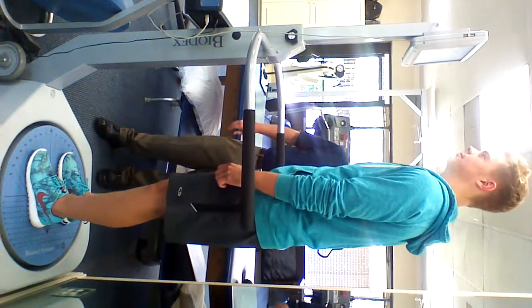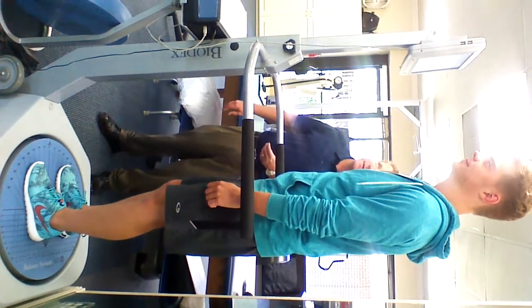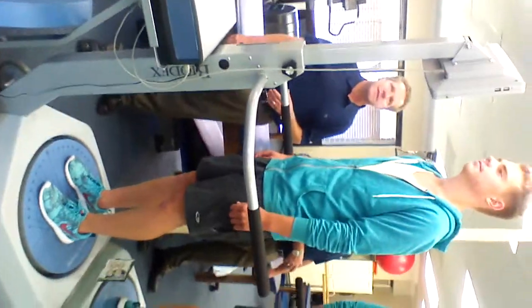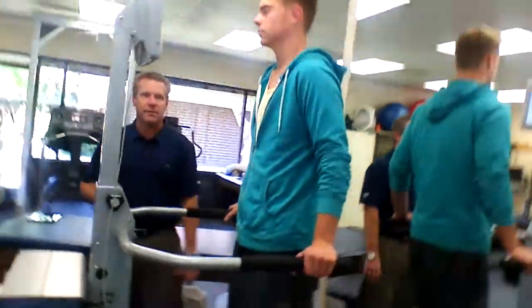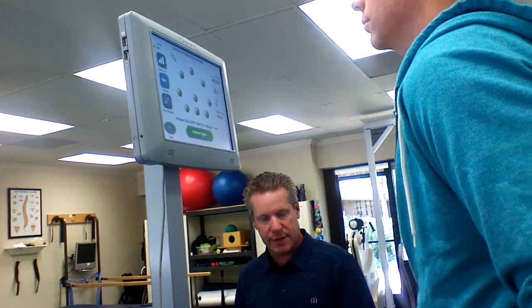This is a free trial test that you would get the results afterwards. So although this is a test, I use this for training people, especially people that have hip issues, even core stabilization — teaching people to shift their weight and maintain a stable spine. For instance, if I was using this for a back patient, I would have it on this mode versus the training mode where the platform is flexible.